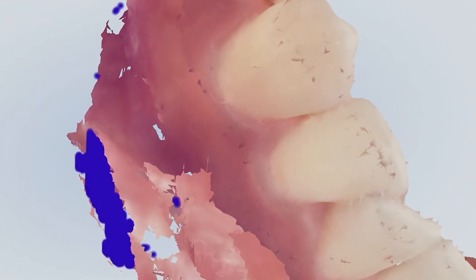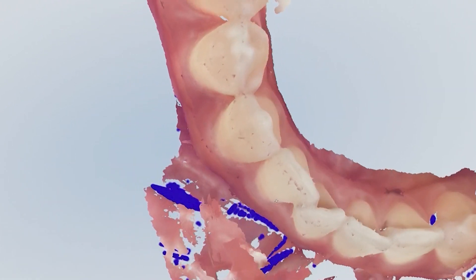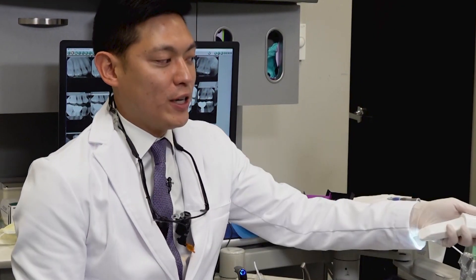There are some areas that are missing and I may need to change the angulation, but you want to see that the teeth positions on the digital model do accurately match what the patient has. With those misalignments, you may see layers to the teeth, and that's usually an indication that there was some sort of misalignment that occurred.